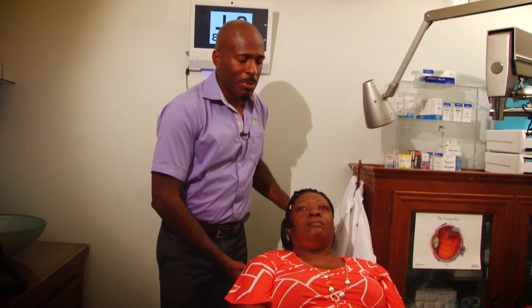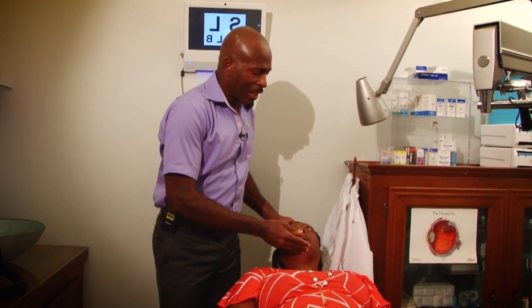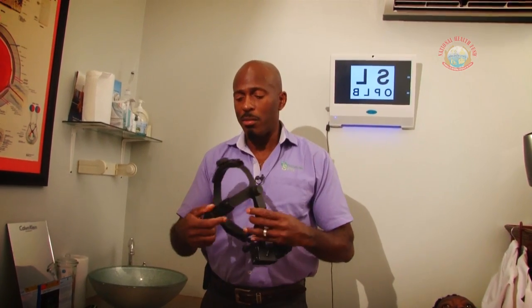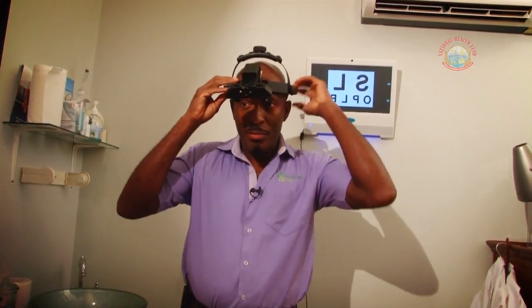I'm going to go back. So the patient has to be laid back somewhat so that we can have visibility of the full extent of the retina all the way to what we call the ora.